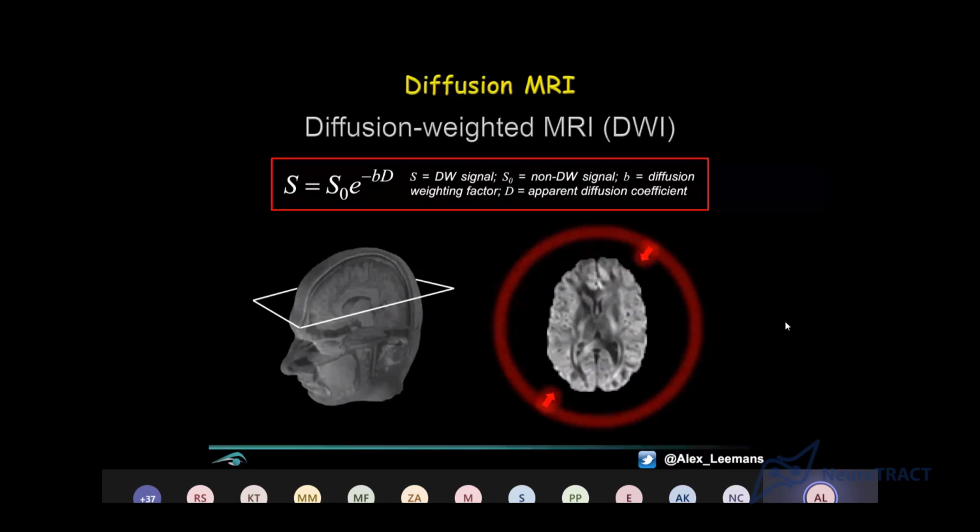It was only in the 1980s, like 1985, 86, that diffusion weighted imaging was actually proposed by Denis Le Bihan. And the B comes from his name. He admitted, I called it B value because of Bihan. It's a bit narcissistic, but I can see the fun of that. Anyway, this B value is named after Denis Le Bihan.